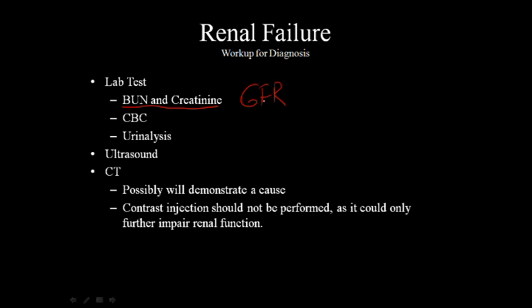And then this is one of those things where you have to decide what you want to do: CT or an ultrasound. Once again, ultrasounds are user dependent, so we're going to write user dependent. Whereas CT really isn't. Also, there's a lack of availability of 24-hour coverage in some facilities, and that is one of the strikes against ultrasound.